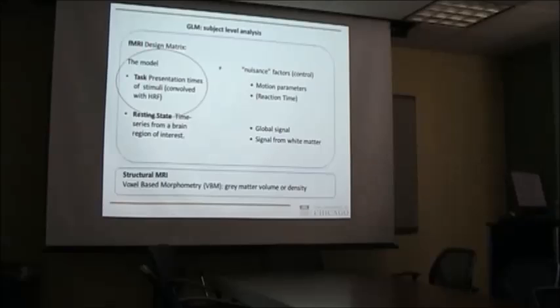And there's other stuff you might want to include. Say you want to see if there are brain regions that relate to reaction time on a trial-by-trial basis. You might want to include reaction time also in your model. So you can include many different things. But I guess the basic point is that the example was just a little simplified, in the sense that the actual model does include a few other variables, either to control for nuisance variables or because they are of interest.